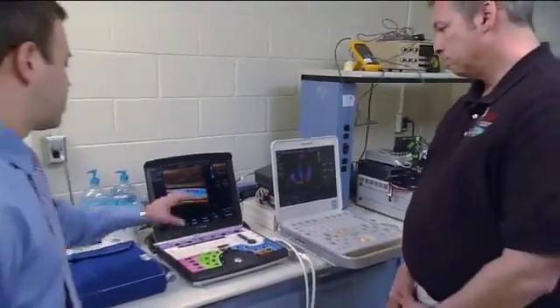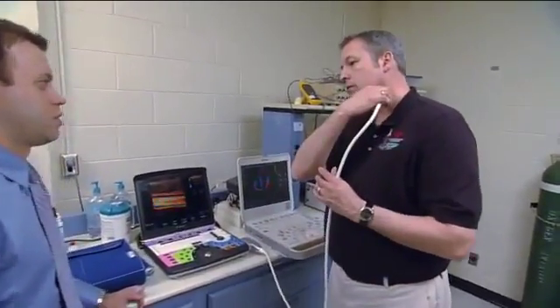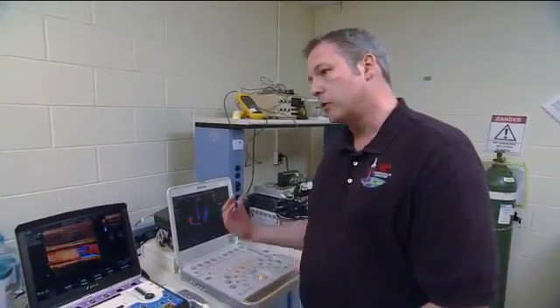Okay, so where do they take this? Is this an artery in the neck? Yeah, right here in the neck. Okay. So you take a probe like this, and you just stick it up there and take a look at it. Now, do they do it to themselves, or do they have a fellow expedition member help them out? We've done it both ways. For this one, I believe we're going to have them do it themselves, and we're going to have someone on the ground do the remote guidance like we talked about for the previous study.